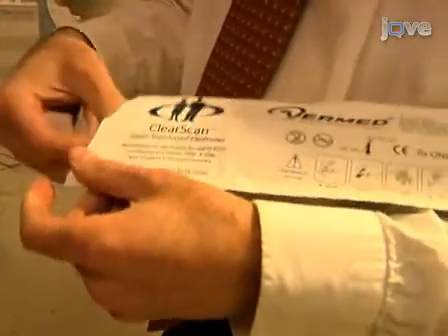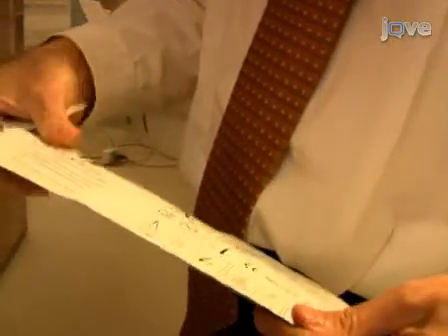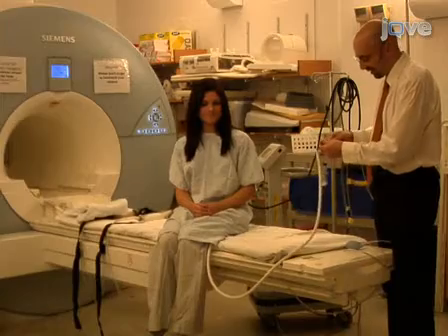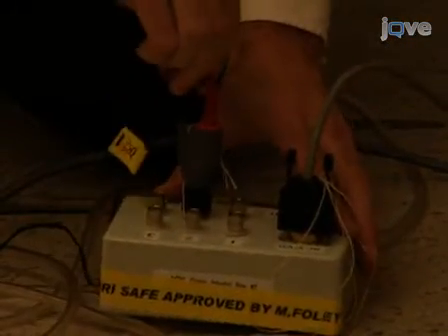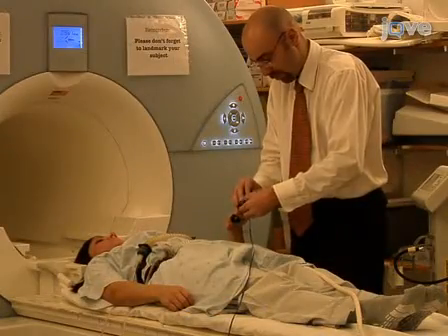Now gather the ECG monitoring devices. You will need 4 ECG electrodes and an ECG cable connected to an MRI-compatible rolling portable cart. To measure skin conductance, plug 2 SCR connectors into the breakout box in the scanning room and have skin conductance gel ready. Now let's begin prepping the subject for the scan.